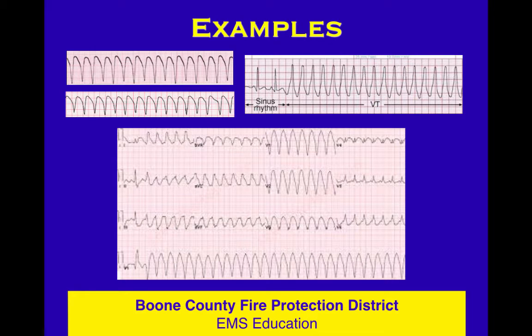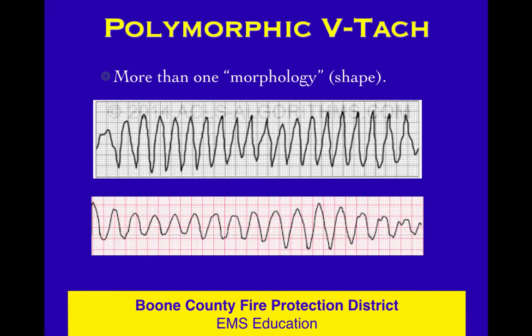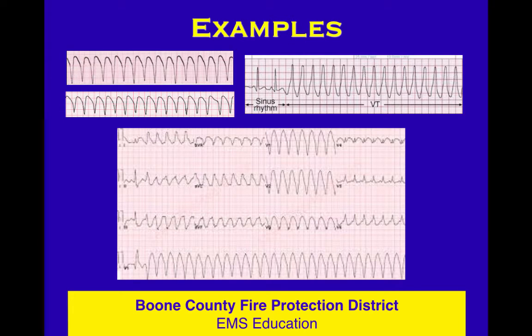Here are some examples of VTAC. I particularly like the 12-lead view because look how differently the rhythm appears across leads. Compare V4 and V5 to V1 and V2 — in V1 and V2 it's clearly VTAC. Hospital 12-leads print a long strip of the same lead throughout your 10-second acquisition, so you can see different patterns. Look at the different leads and how differently VTAC shows up. A wide complex tachycardia is VTAC until proven otherwise.